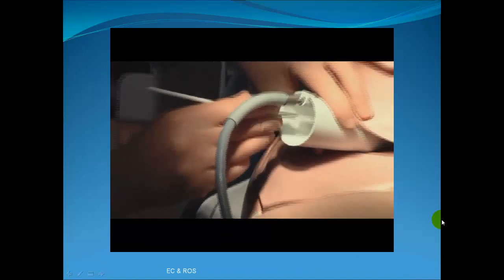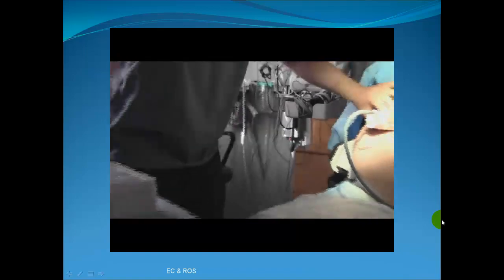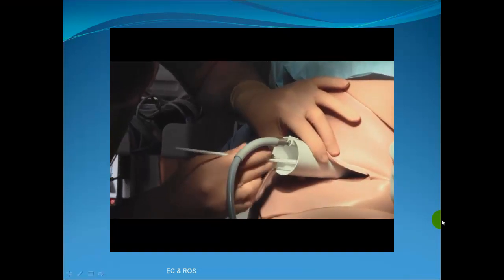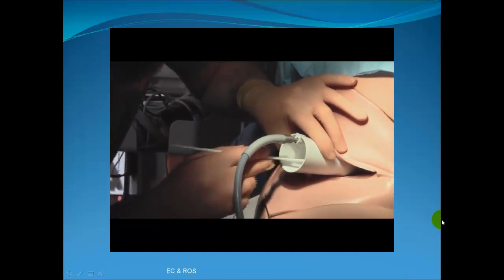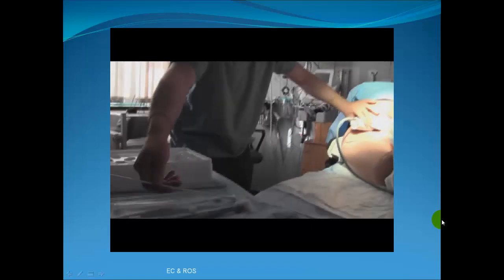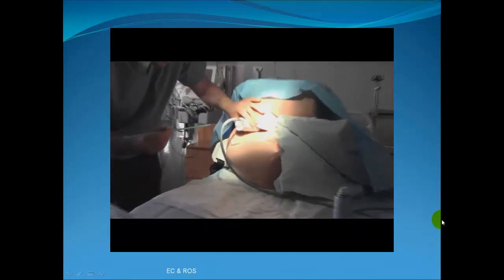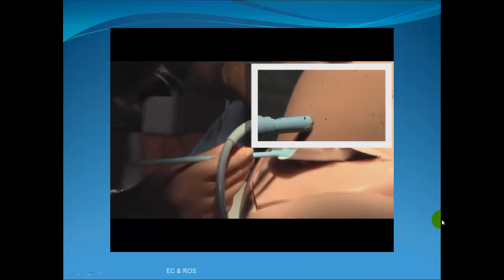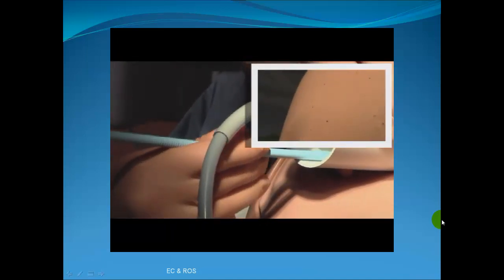Apply soft white paraffin to the area via a long swab. This aids the formation of a bleb of blood by altering the surface tension, preventing the bleb of blood from running. Now, with your blade, firmly make a stab incision, breaking the surface cleanly. As on the screen right now, if a second incision is needed, do it 90 degrees to the first.